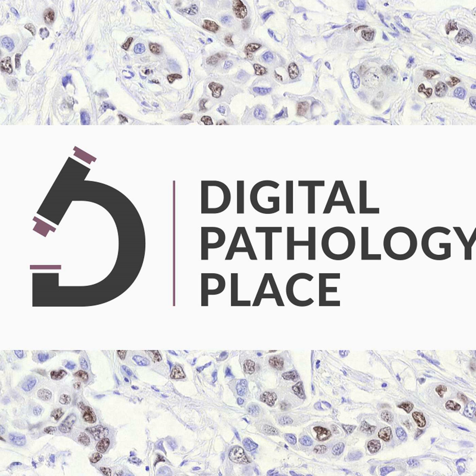Yeah. And going back to the theme here, that's the ideal of digitally ready, right? Finding that sweet spot, working towards standardized chromogenic IHC, recognizing that a 4-plex or an 8-plex can actually show us more information about tumor microenvironment and therapeutic response. We want that information, we want those data, but going too far beyond that introduces variables that we cannot standardize. So I think it's a dance between more information and standardization, to create a workflow that is ultimately locked down, can be regulated and used with a degree of confidence, and achieves that gold standard of digital readiness.